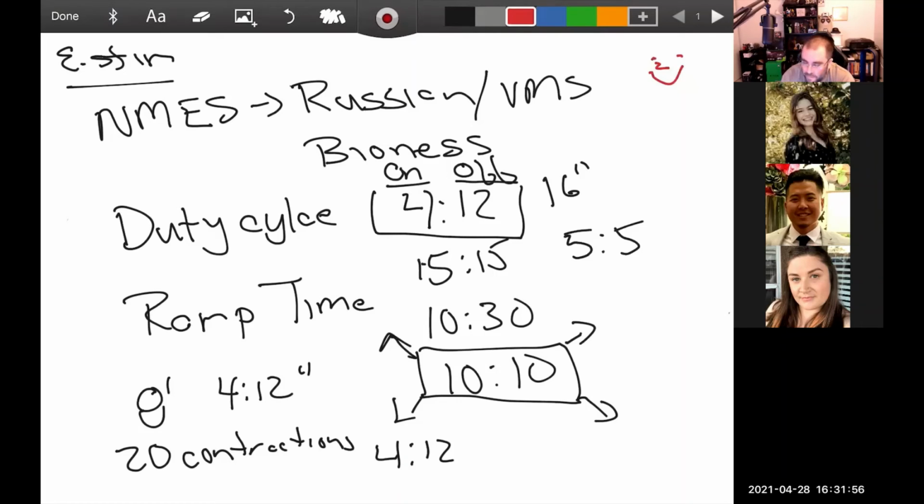She also mentioned that looking at our parameters for NMES, we're just going to use 40 PPS for muscle tetany, and it would never go lower than that. Yeah, that's the frequency, so that would be 40 hertz. The reason she said you're pretty much going to use that is that muscle tetany means a full contraction, right?